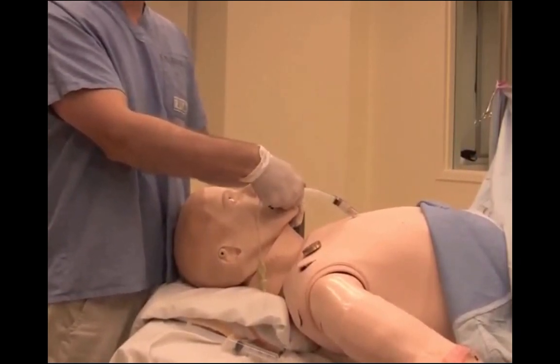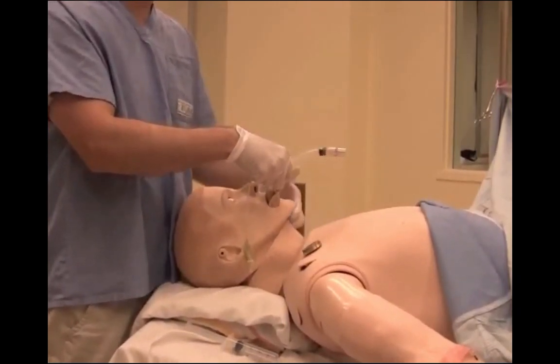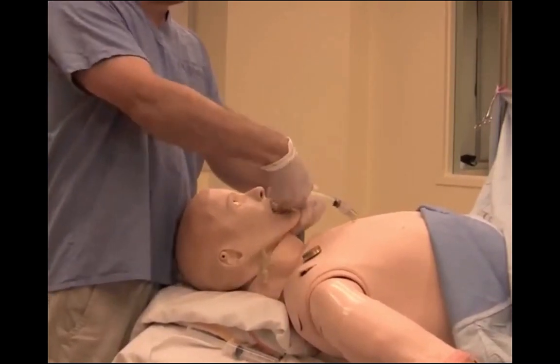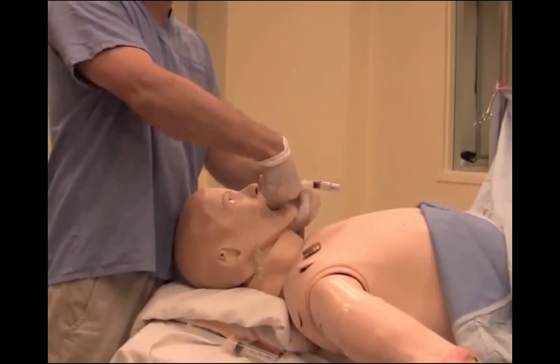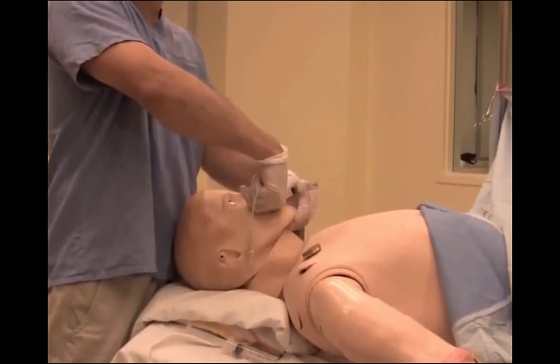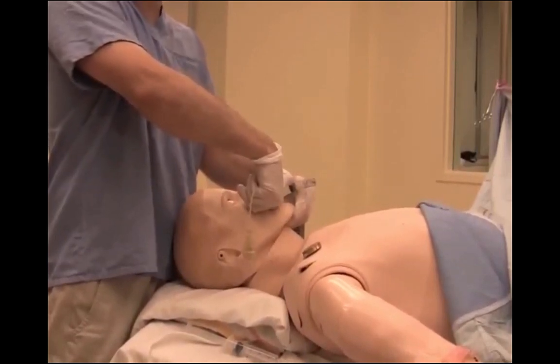Another technique for getting the tongue out of the way would be to hold a tongue jaw lift, or to do a jaw thrust, in order to promote advancement of the tongue forward. As you advance the LMA, it should slide over the palates, around the tongue, and as you push as far as you can with your hands, you should finally meet resistance.